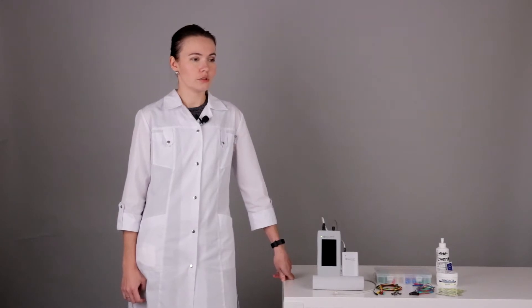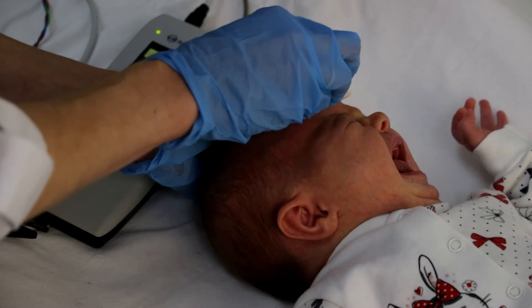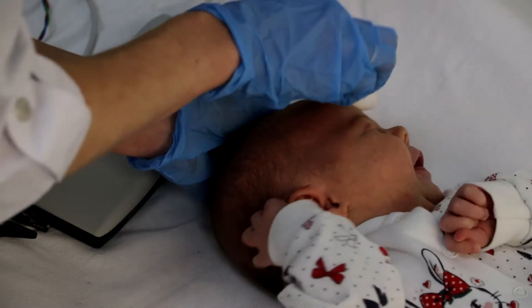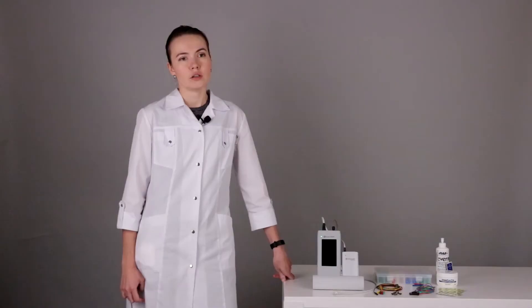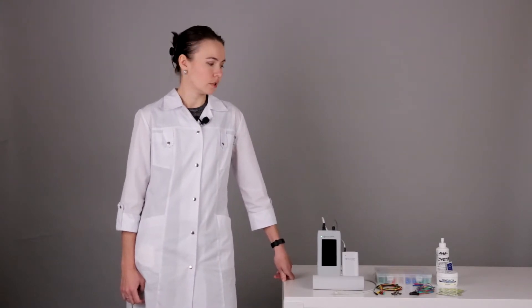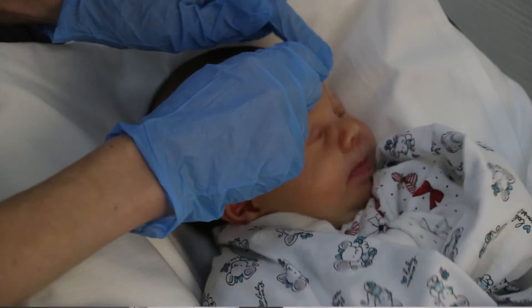In babies, we can use only abrasive paste and not alcohol. Using the abrasive paste helps to decrease the electrode impedance. We need to gently rub the skin until slight redness, and after that we can position the electrodes.